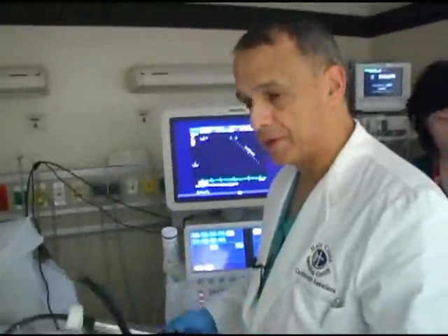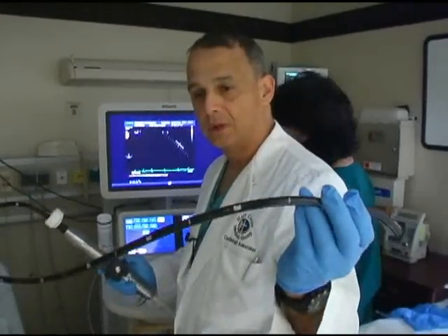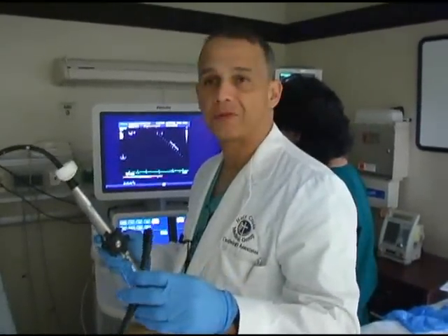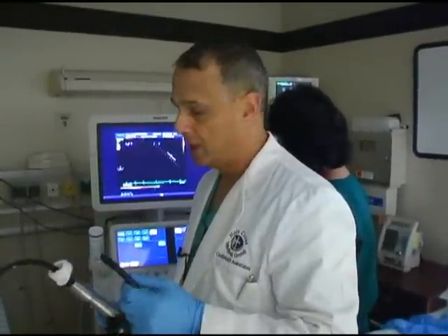The transesophageal probe is basically a sonographic transducer that is mounted on a flexible tubing, similar to what the gastroenterologists do when they do upper endoscopies. We're going to be inserting this through the mouth and into the esophagus and stomach to take pictures of the heart from different angles.